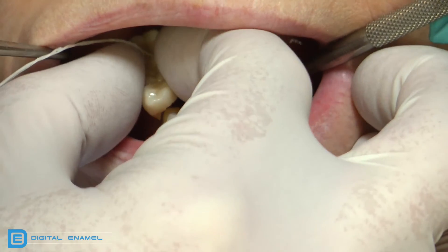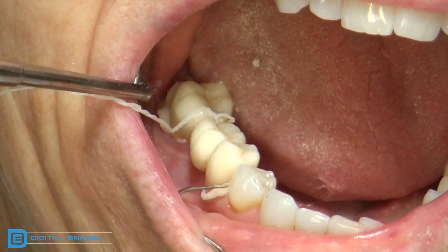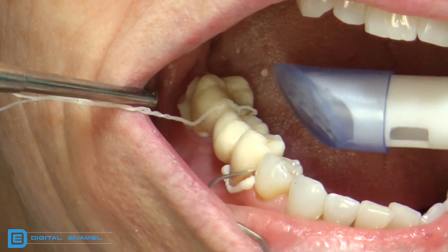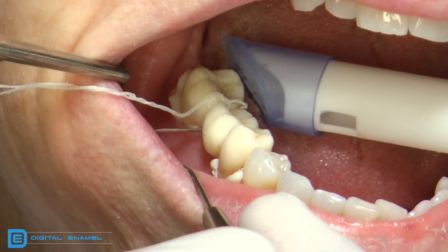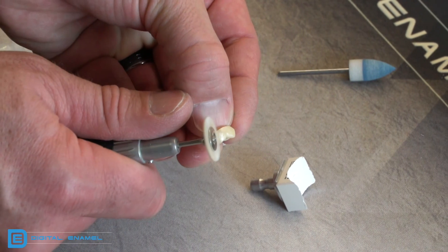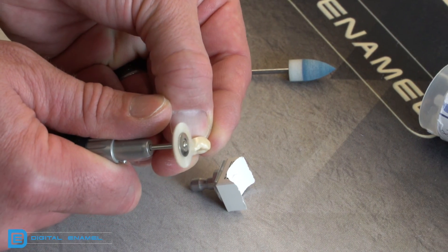The greatest thing about zirconia restorations is that if you have good mechanical resistance or retention form, you can traditionally cement them. This is a bridge we put in that was simply cemented with Fuji Plus, a resin-modified glass ionomer. If you need to adjust your zirconia restoration's occlusion or interproximal contact, use a light diamond less than 40 microns grit, then take the time to polish it extremely well — those little adjustment marks are potential fracture lines for the restoration later.